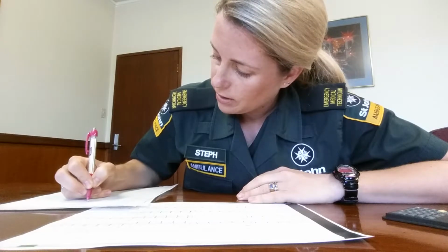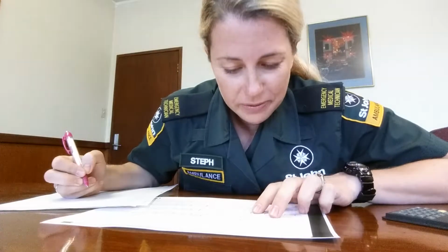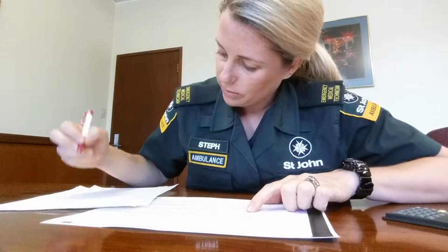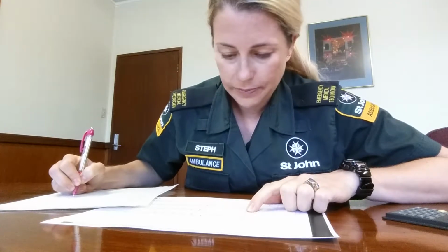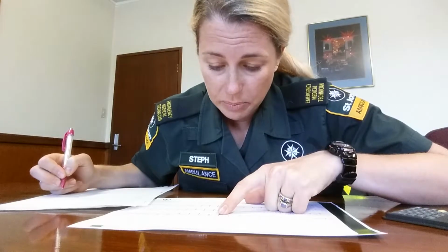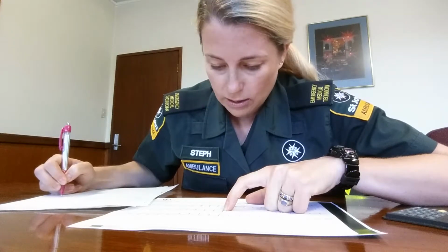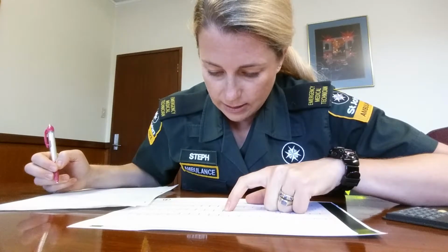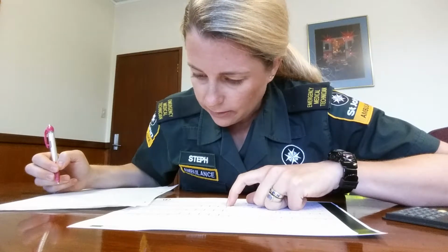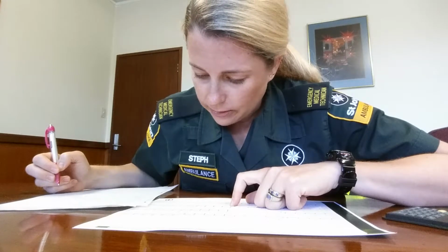So I'd want a V4R to look at reciprocal changes. Yes, I would want that, but I'm looking for reciprocal changes in 1 and AVL, which there is some in AVL, so I'm quite certain that we have inferior. Looking in other leads as well, we have quite significant depression in V1 and V2, so I'd want a posterior ECG as well to look at reciprocal changes for that. And I do have elevation in the lateral leads as well.